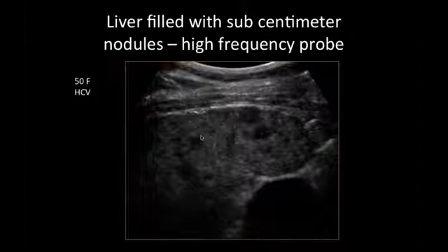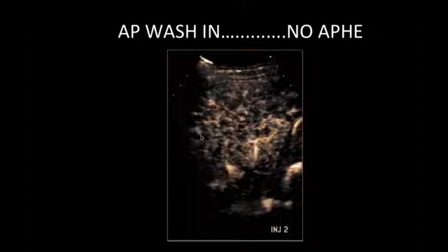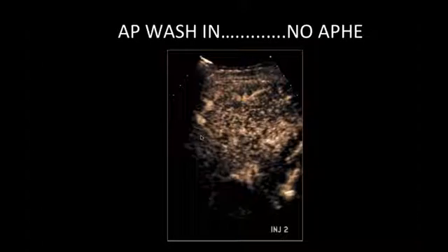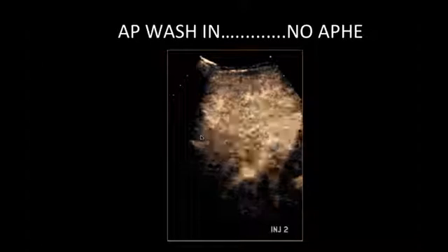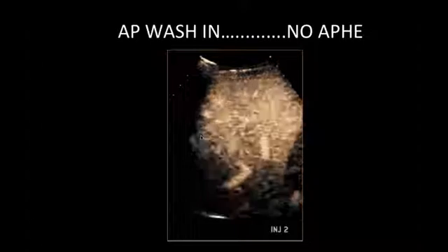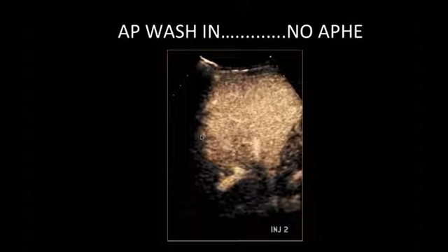So now we've dealt with all of this portion of our slide, and now we're looking for tumor in the vein. So when we do our grayscale evaluation, we're looking for evidence of a soft tissue tumor within the vein. And so this includes both the portal venous and the hepatic venous assessment. And with these vein soft tissue densities, we may or we may not show evidence of a mass lesion within the liver parenchyma.